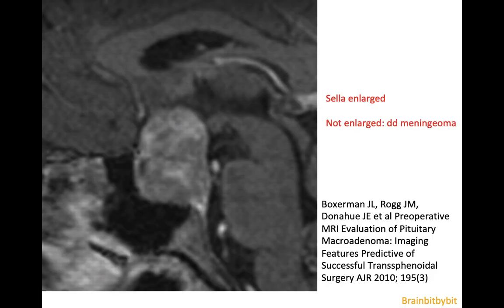When I look at the sagittal images in patients with a sellar and suprasellar mass, the first thing I look for is whether there's enlargement of the sella. If the sella is enlarged, it's most likely a macroadenoma. If the sella is not enlarged, you can think of other pathologies such as a meningioma.